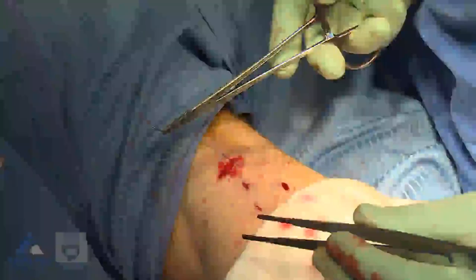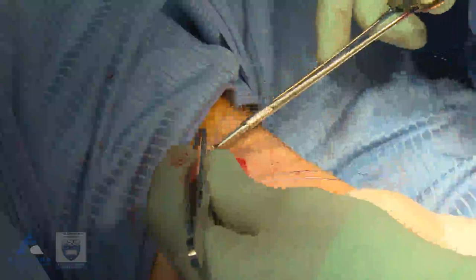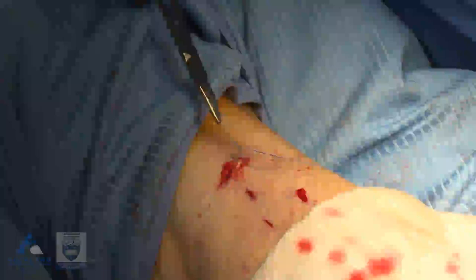The next step is a deep bite through the full thickness of the skin and subcutaneous tissue. Then loading the needle in a reverse fashion — the same thing but in a backhand fashion. Then taking a superficial bite just through the skin and subcuticular tissue. The next stage is to put a throw — the first stage of the knot — which is two throws around the needle holder. So we've got a double throw in that direction and then a single throw back in the other direction. So there are basically six steps.